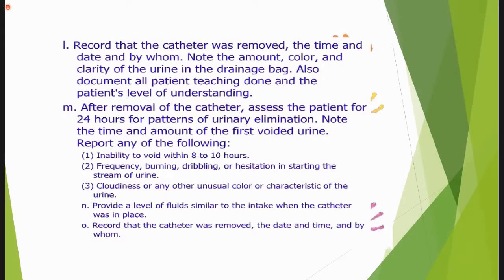Provide a level of fluid intake similar to the intake whenever the catheter was in place. Record that the catheter was removed, the date and time, and by whom.